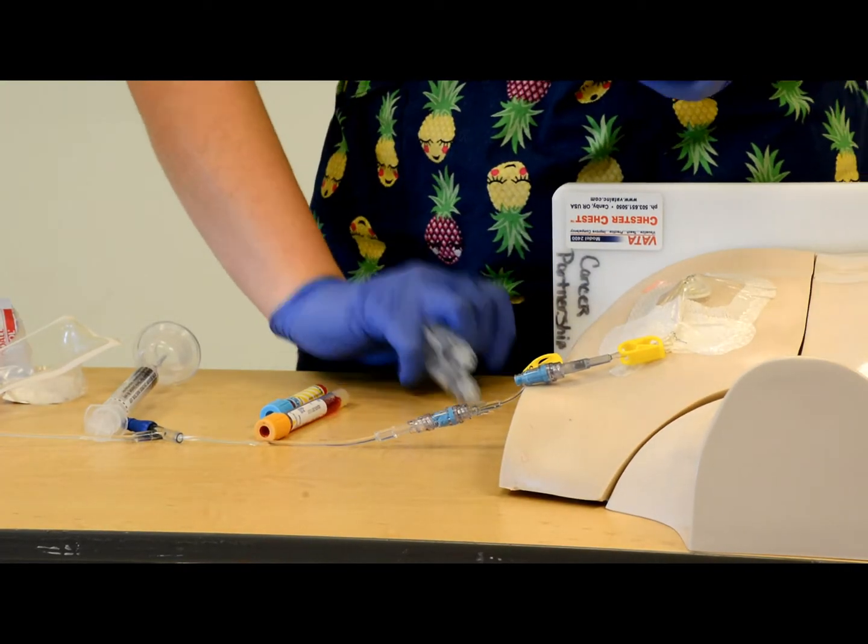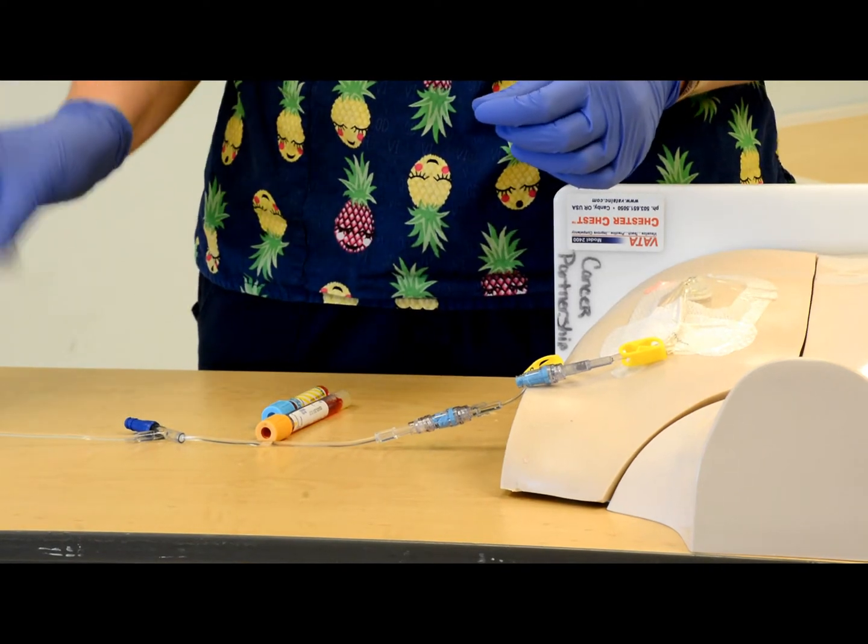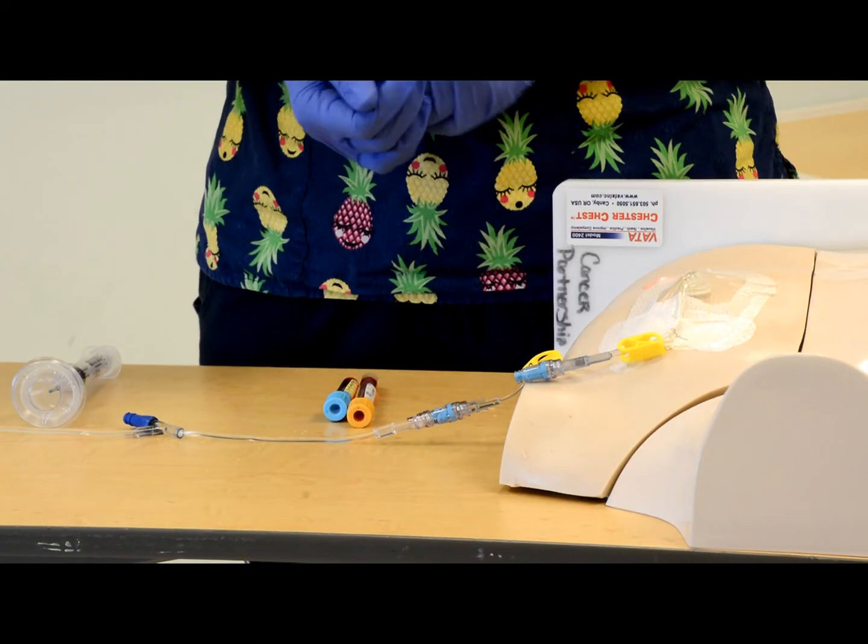Now we can dispose of our garbage, and make sure that your transfer device goes in the sharps container, and your tubing gets labeled. Good job!